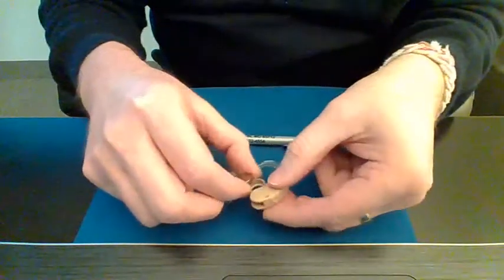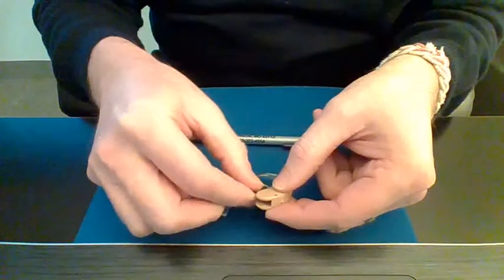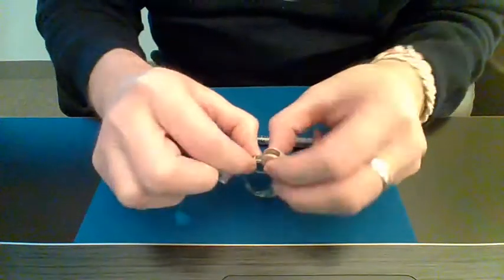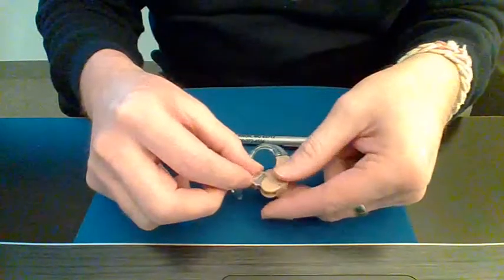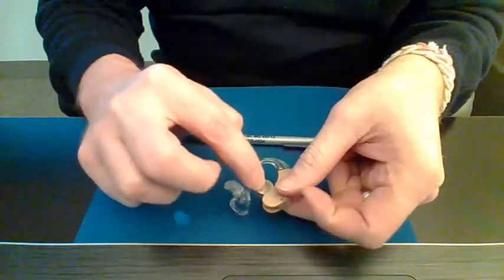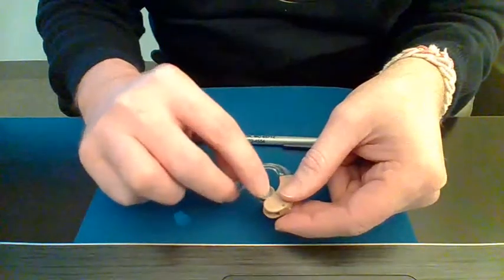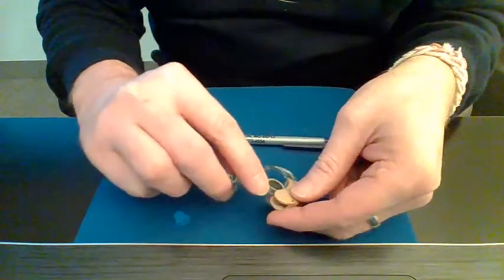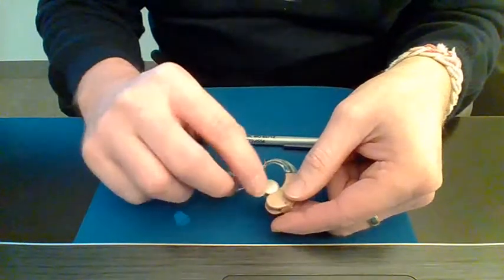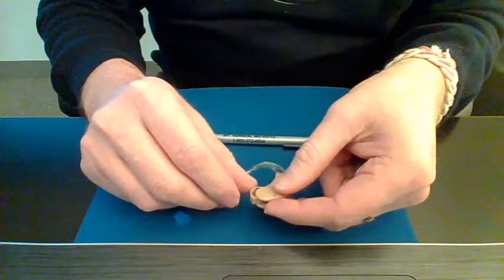And you just take that, you want that plus sign to face out, the beveled side to go down. That just fits in that little door nice and flush. You want to make sure that anytime you put a battery in, whatever style hearing instrument, that it sits flush. You don't want it to be too shallow or too far down or stick up too far, because you don't want to break the case on the hearing instrument when you try to shut the door.